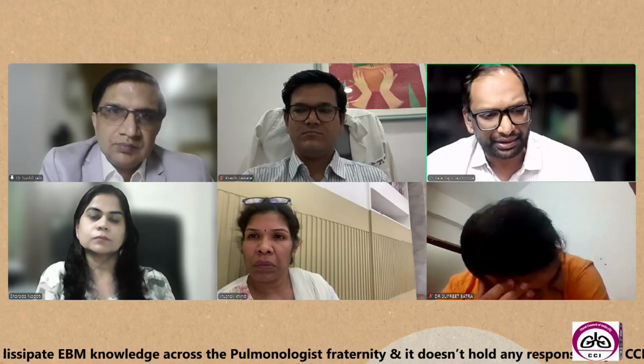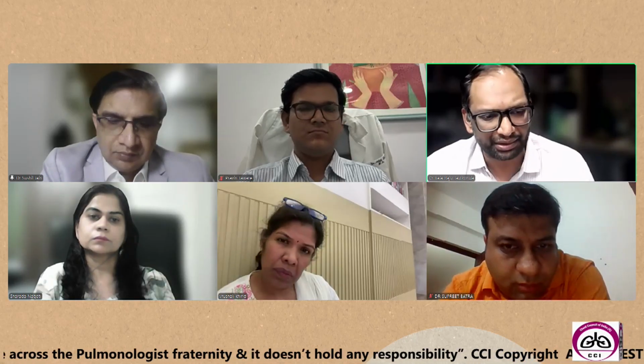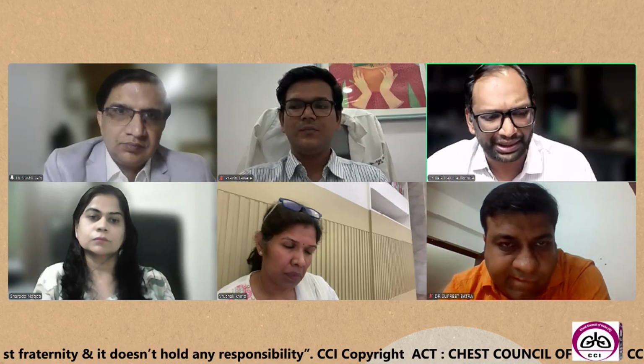The problem here is if you don't take adequate samples upfront, then your chances of rebiopsy increase. That's what I feel. In most of the centers, this is what is lacking. One, probably they are not using the right anesthesia to make all the passes and to select the node.